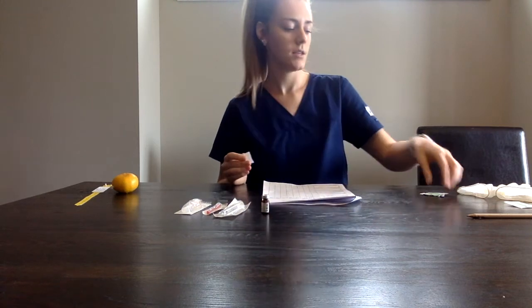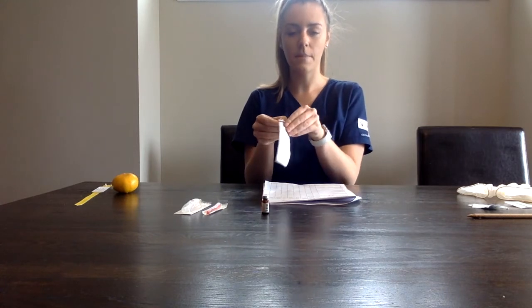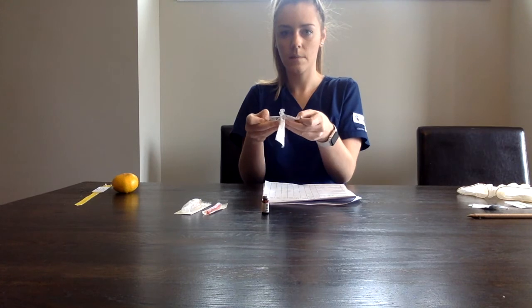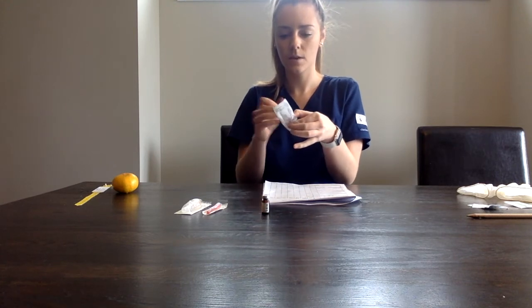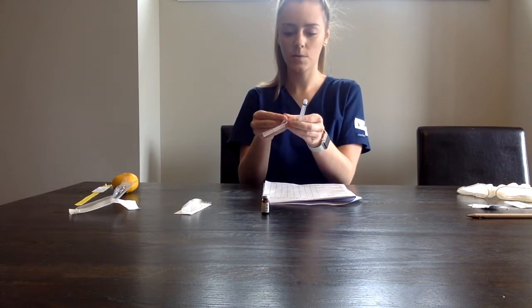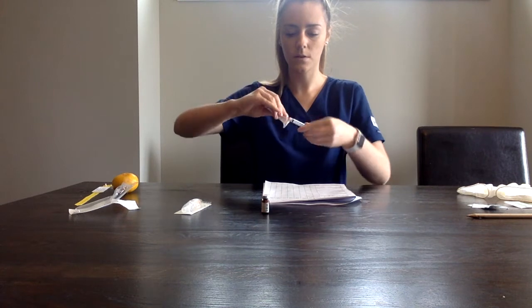Okay, so it's been 30 seconds. We can throw the swab in the garbage. And we'll open up our supplies. We want to peel it backwards to maintain sterility. So peel it back like that. You can take it out. And we want to do the same for our blunt-fill needle, just pulling it back. And then we can attach the two.